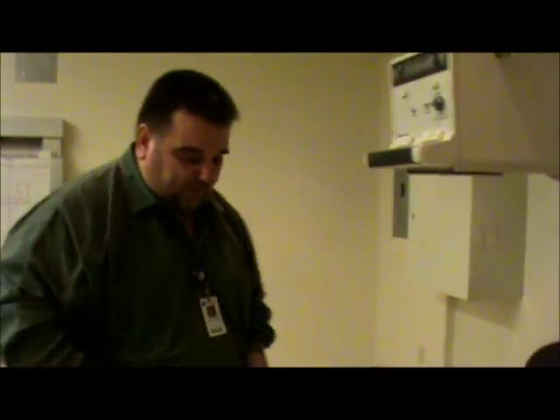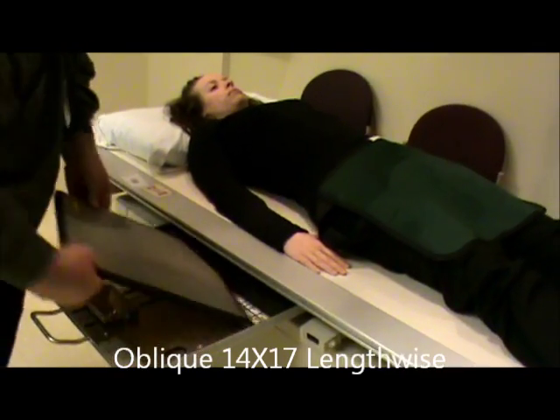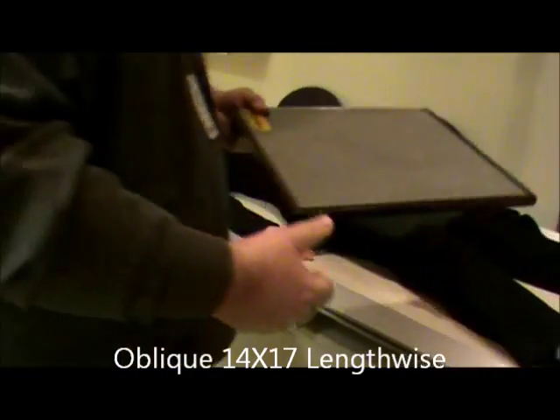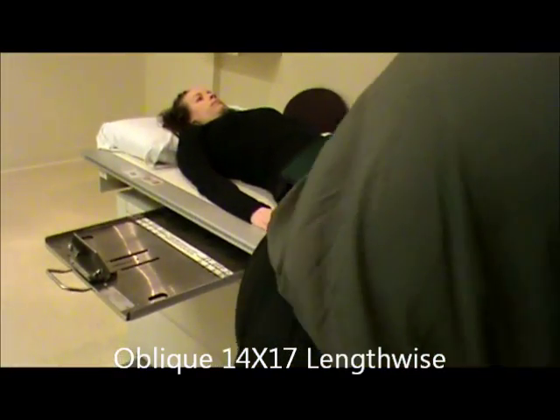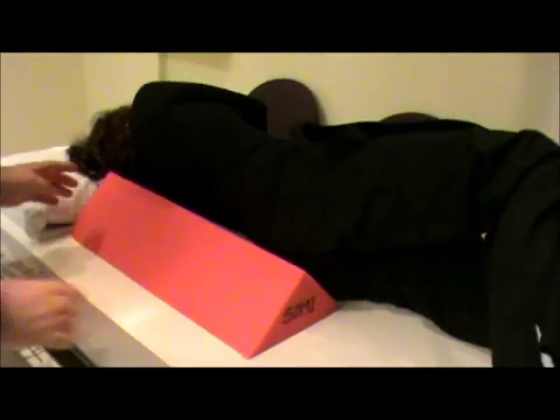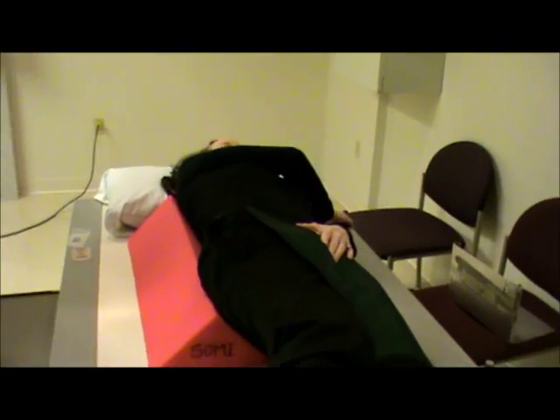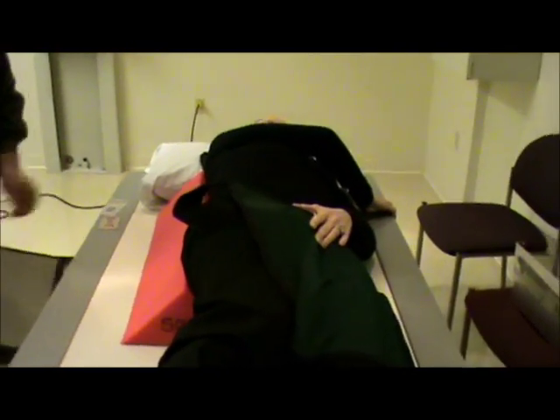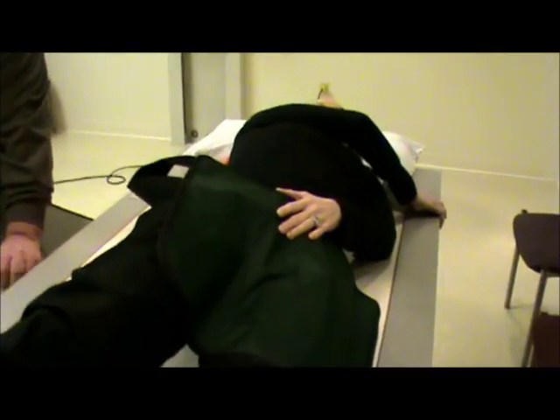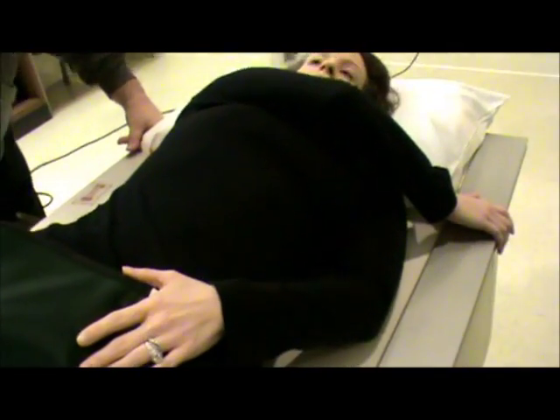Now I want to demonstrate how to do an oblique for the kidneys. Film size goes back to a 14 by 17, lengthwise. I have the patient roll up toward her left side and lay back — she is now in the LPO position. Since we're in the LPO, we're going to use the left marker on the left side of the film.